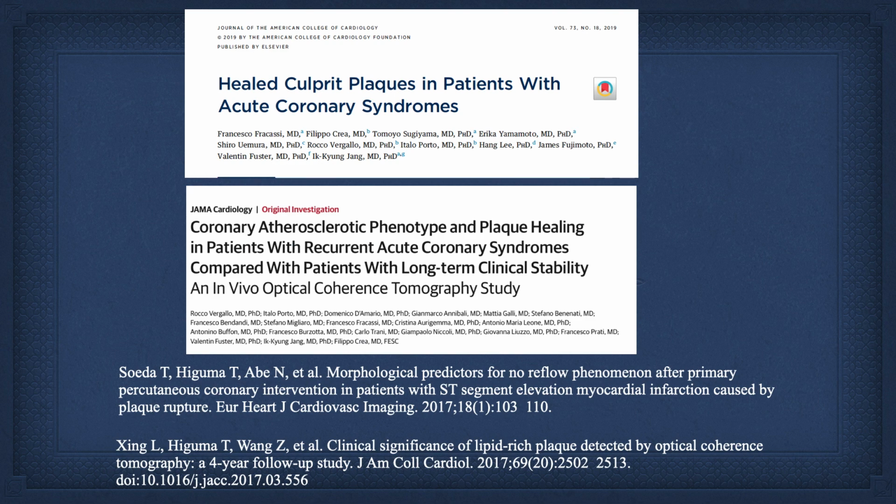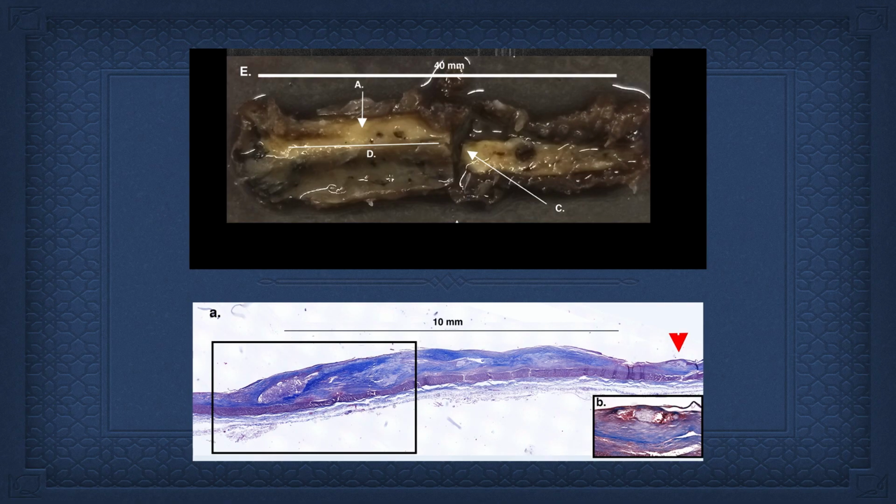I recommend people read them for themselves and don't just read abstracts and the end of the papers, look at the papers. But it was from the tables of these, including these four papers, where they looked at plaque length, core length, and core volume. We saw that this concept that long cores are bad seemed to be confirmed. And that's what I really got out of these papers. Maybe somebody else got something else, but that's what I got out of it. And so here's an example of a core that's 40 millimeters long.